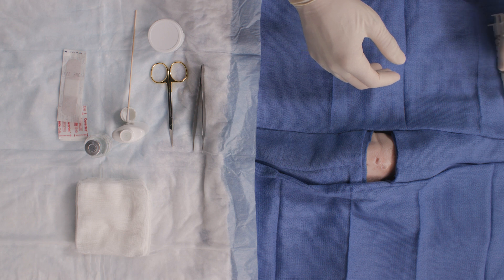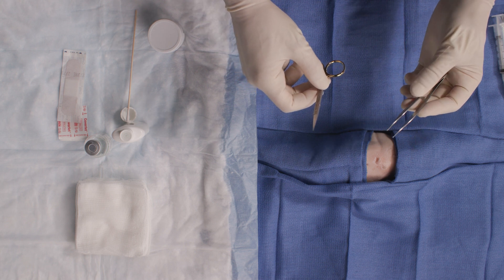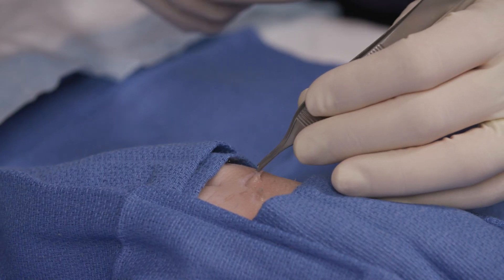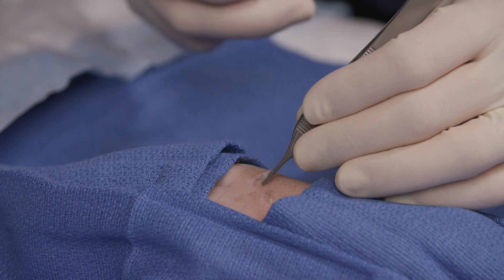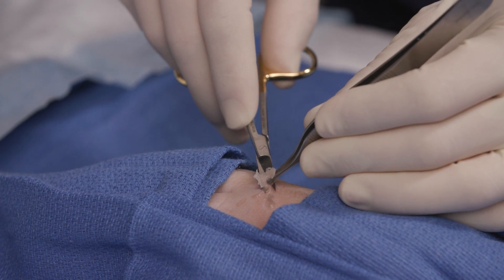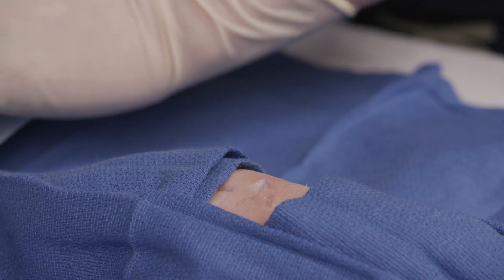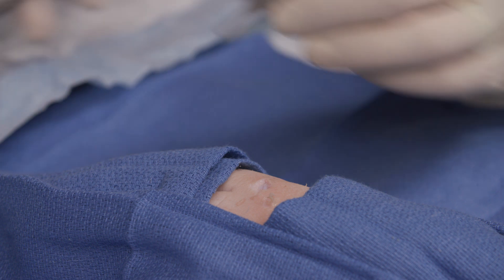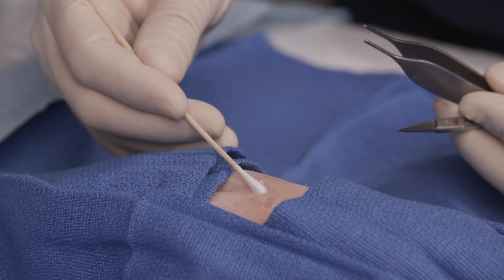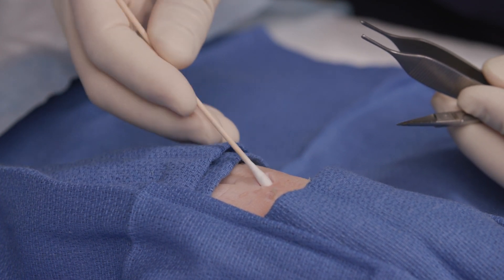I'm going to cover my anesthetic needle and set that aside. For the actual snip excision, the two instruments you really want to focus on are your forceps and your iris scissors. I'm just going to gently grasp the skin tag with my pickups. Then at the base or the stalk, I want to get as close and flush to the skin as I possibly can, and make a confident, clean snip to excise that skin tag — then set it aside. I'm confident these are skin tags, so I don't need to send them to the pathologist. If there's any bleeding, I can quickly apply some Drysol with my cotton tip applicator directly to the site. Make sure it's hemostatic and there's no bleeding.